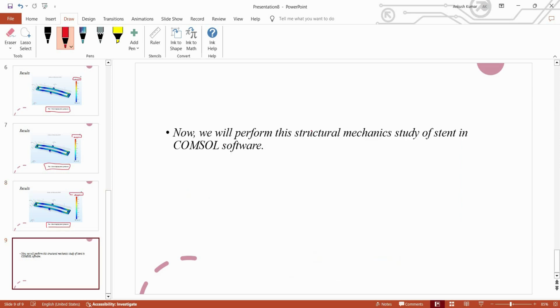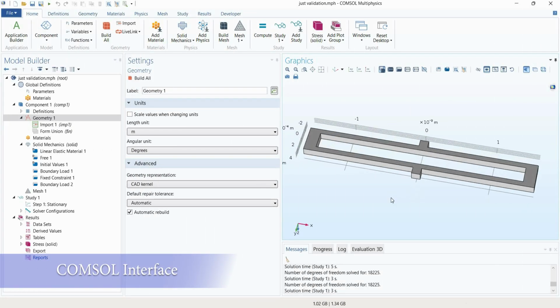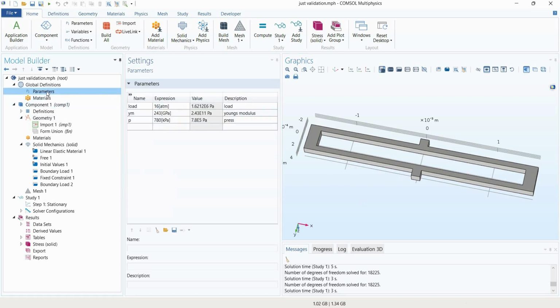Now we are going to solve this particular study in COMSOL software. This is the design of a single part of the Stent, which we made in SolidWorks and then imported into COMSOL software. First of all, we have to define the parameters. In the parameters section, just type all these things: load will be 14 atm, this is the Young's modulus, and this is the pressure which is applied on the outer wall.